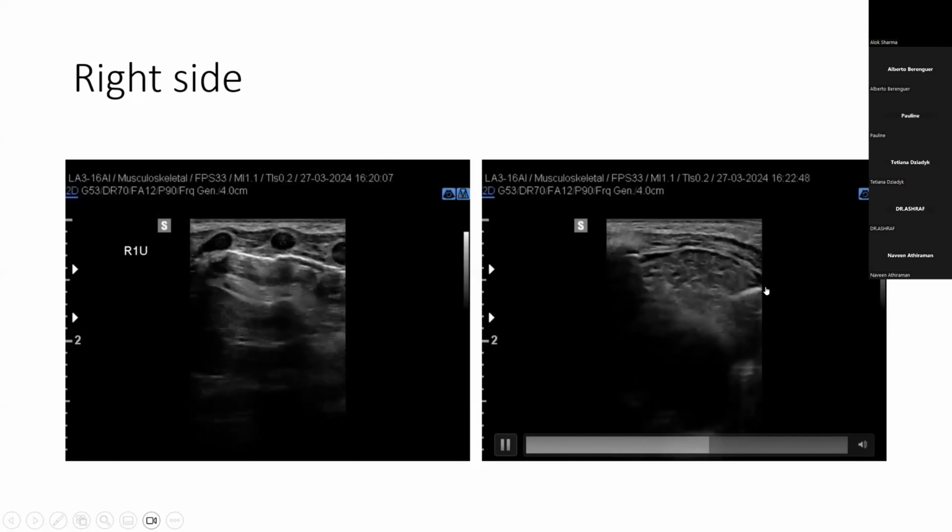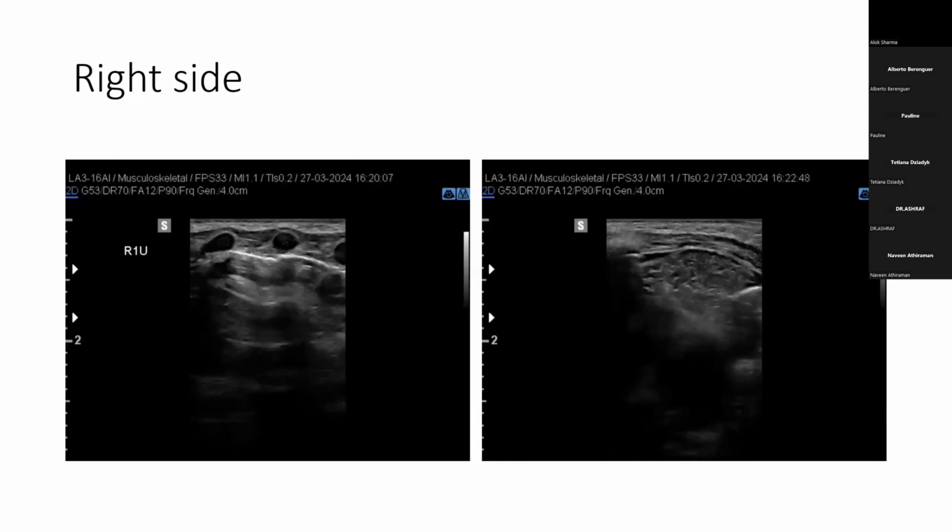But it was difficult because it's a quite small footprint, the hockey stick that we have, and I didn't try it with a large one. That's what I'm thinking right now. But maybe if I used a larger probe, I could image it better, the two parts.